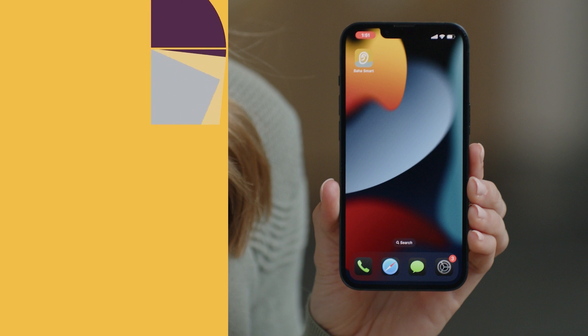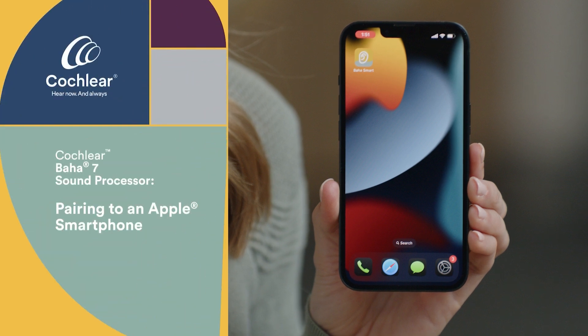We will go over how to pair on an Apple device. If you have an Android, see the user manual for the specific steps for your device. To check your phone's compatibility, visit Cochlear's compatibility website at cochlear.com/compatibility.